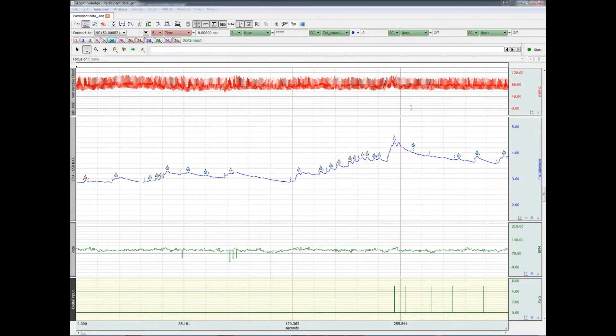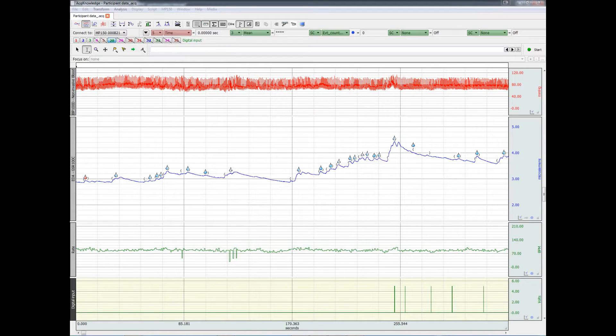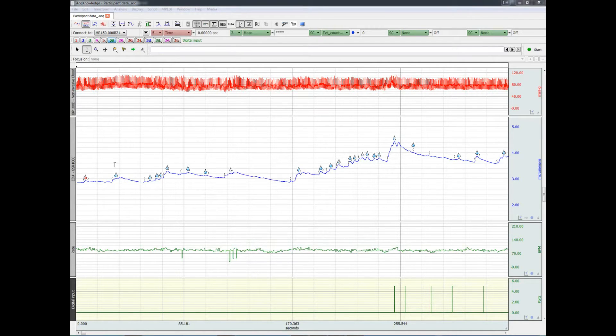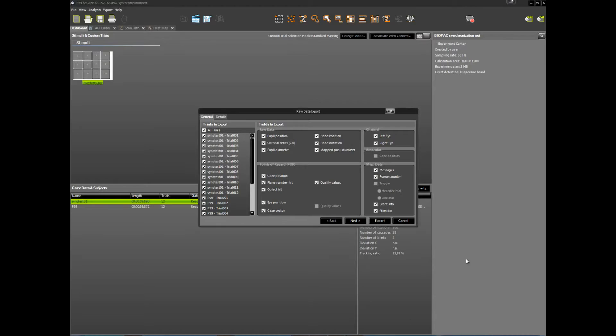Start recording data with ACKNOWLEDGE first and then with the SMI eye tracking system. In this way, when you finish the experiment and you export the data from BeGaze, you'll be able to line it up with the physiological data.